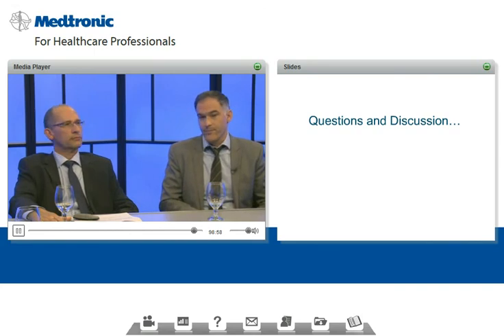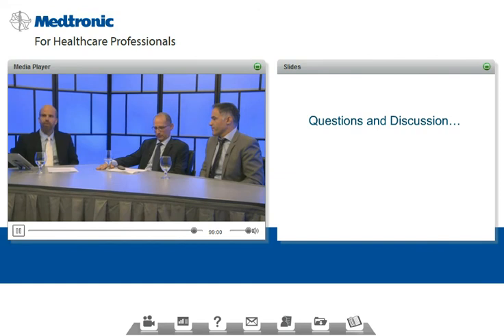Yeah. Very good. Just a couple more questions before we wrap up. These are small technical questions. In terms of the split of basal and bolus insulin delivery, how much attention do each of you pay to that? I know that 50-50 is a bit of a rule of thumb, although I suspect that for a lot of patients we need to perhaps put that aside. So could you maybe comment about how you feel about the split and how much attention you pay to it?